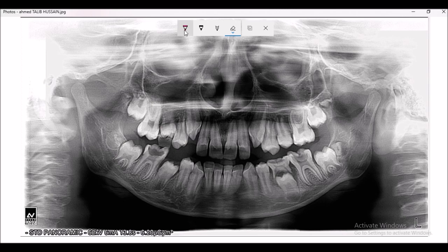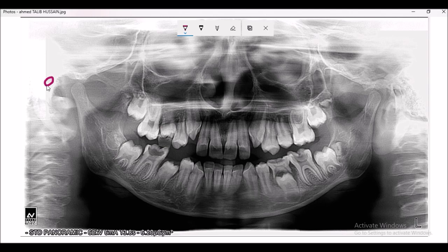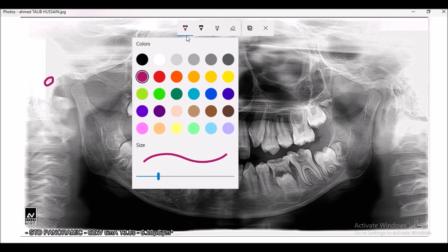This rounded opening over here is the external auditory meatus. You can see it on the opposite side as well. This is the external auditory meatus.